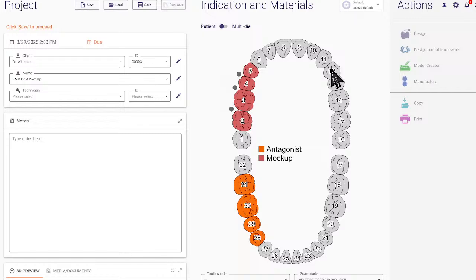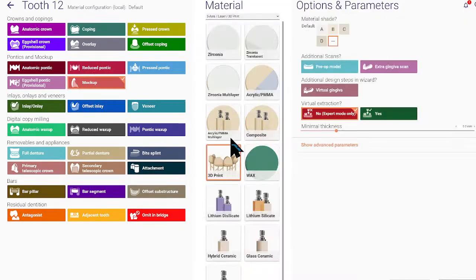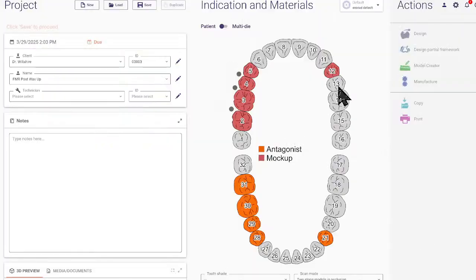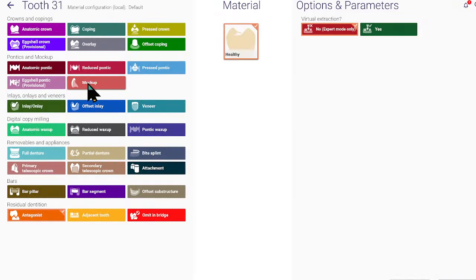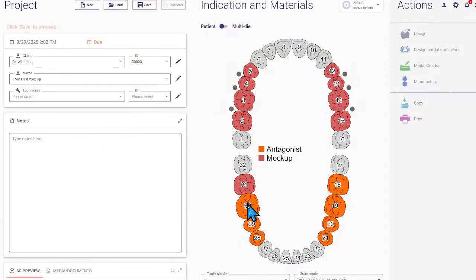So the same thing over here, you're gonna do this one. Select mock-up for the first one. And then you should be able to press Shift and then click all the other teeth and then uncheck them. Okay, like that. And then you do the same thing for the lowers. Press 3D print. So mock-up, 3D print, then you press OK. And then you press Shift and select the others.